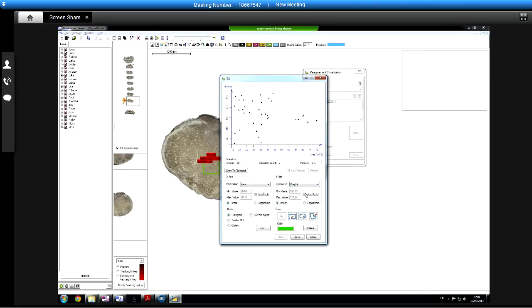So for instance, if you say, I've decided now I'm only interested in the ones which are below 49 microns squared and darker, then you could go, well, that's those ones there, and then again regenerate the data file or whatever. So does that seem useful, do you think?